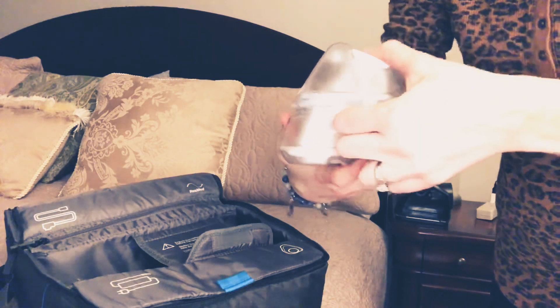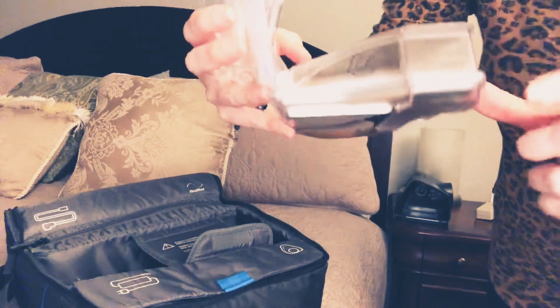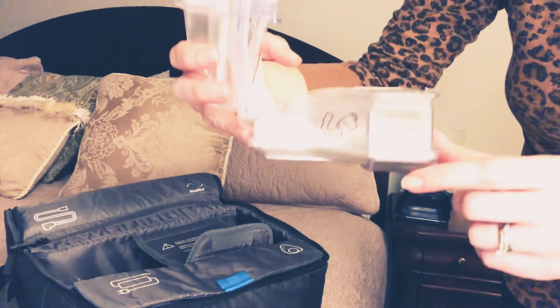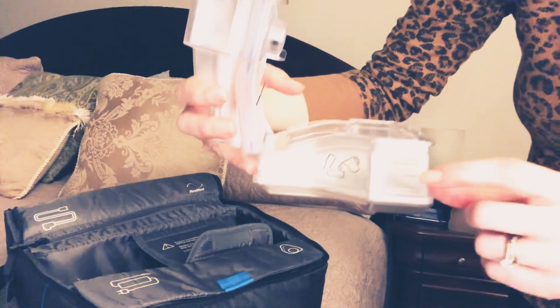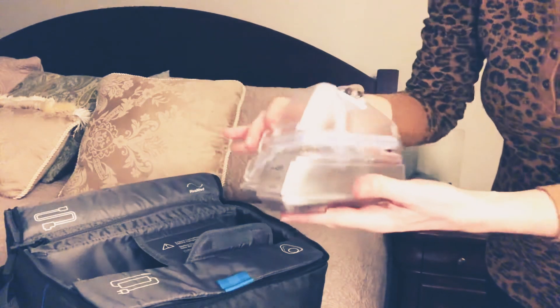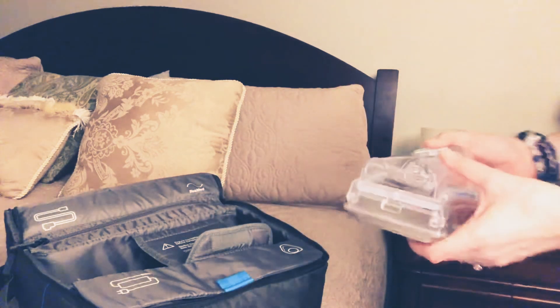Before you use it, you're gonna open it up and fill it with water. It's recommended to use distilled water. I always fill mine to the halfway mark just because I've discovered if I overfill it, I get water in my tubing and up in my mask, which is never fun.